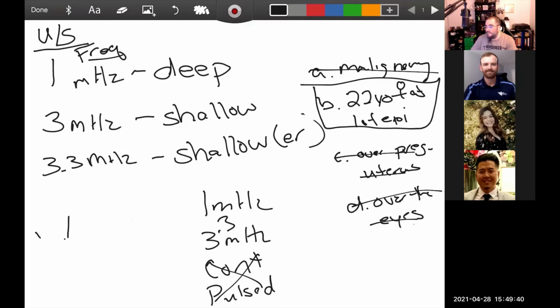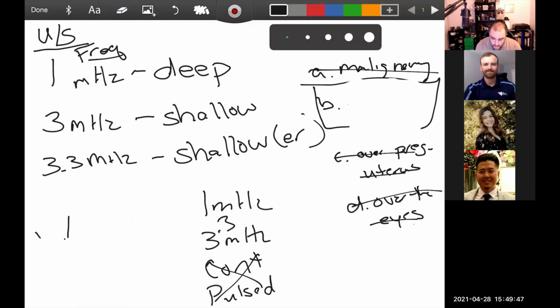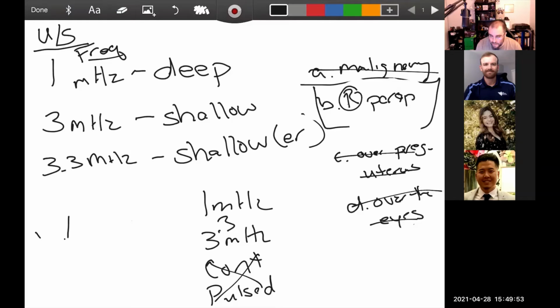Does that make sense? I could also change this and say the right paraspinals. Now, if Brooke thought, hey, I thought we couldn't do ultrasound of the low back. Well, yeah, but out of those, that one's okay. But if it said ultrasound to the interspinous ligaments, that would be a no. We don't do that over that area. That's on the actual spine itself.